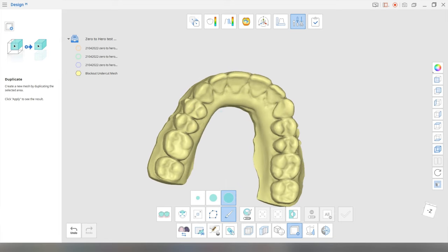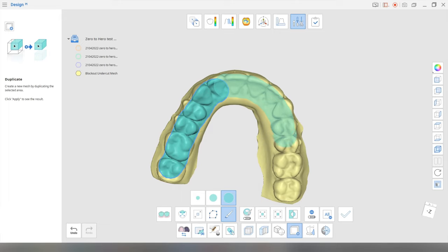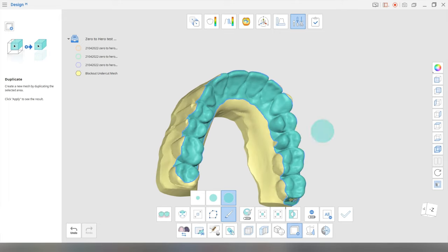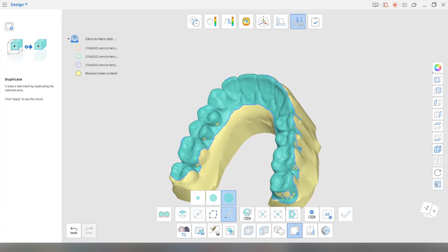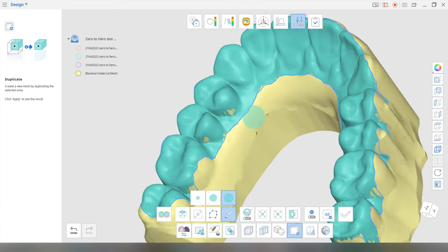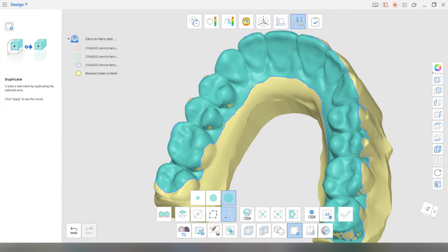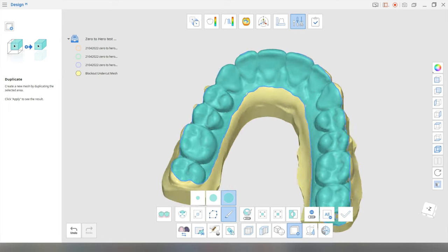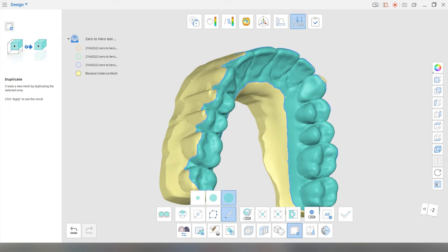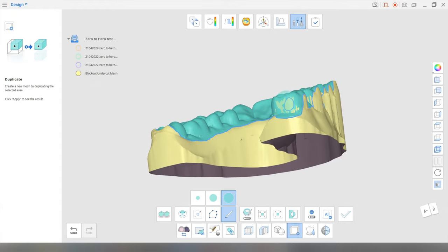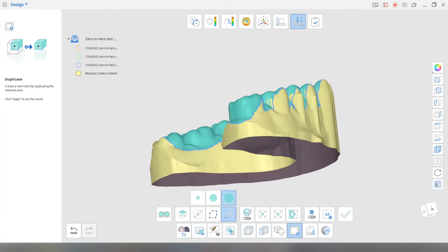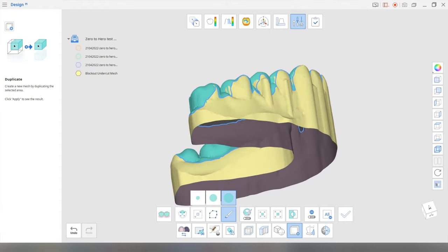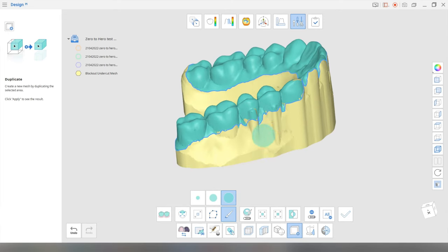And I like it because you just basically hold the left click and you just kind of paint the areas that you want included. All right. So you're going to form that rough outline of your splint. Drag this along. Now you do have to be careful because you want to make sure that you don't have holes like this in your mesh.